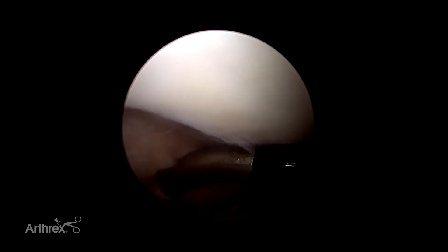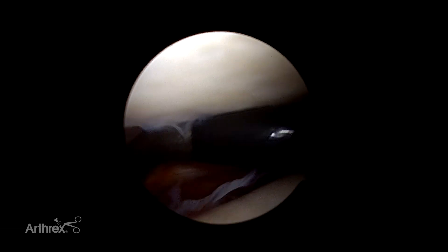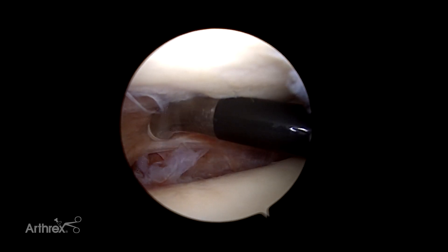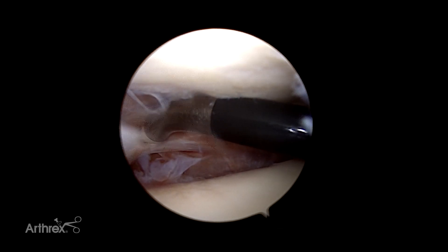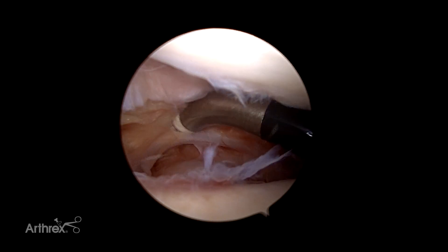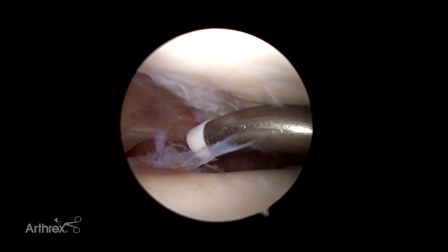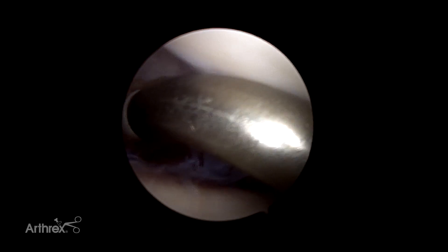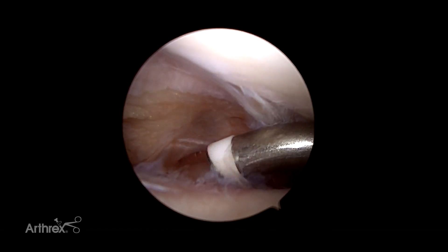You can see I am literally almost at the subtalar joint — I'm so far back in the ankle. There's the posterior tibiofibular ligament, and you can see this probe can get all the way down to the posterior part of the ankle. So if you're trying to get an os trigonum out arthroscopically, I am literally right where the os would sit, so you could actually do your complete synovectomy with this probe and get all the way back.